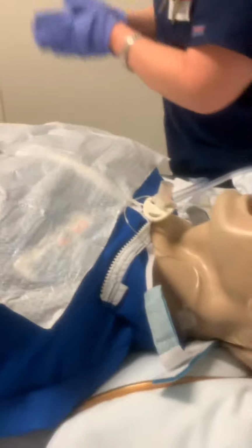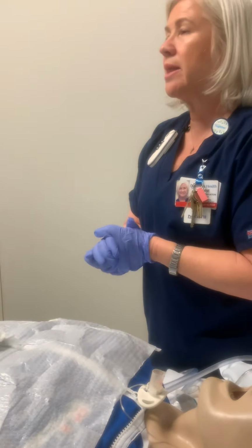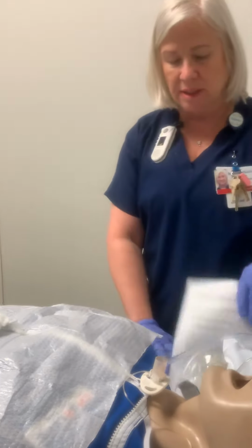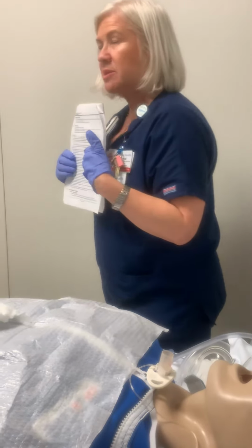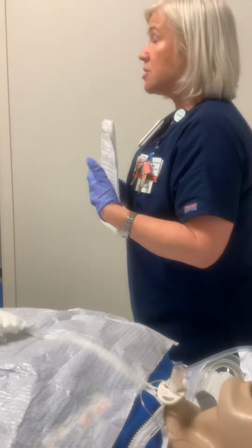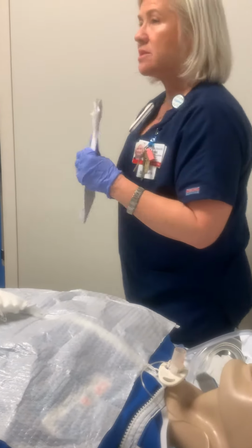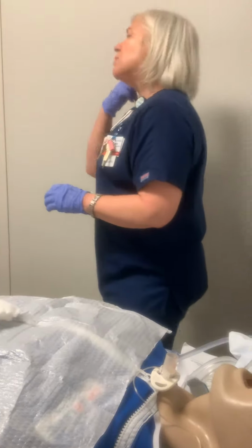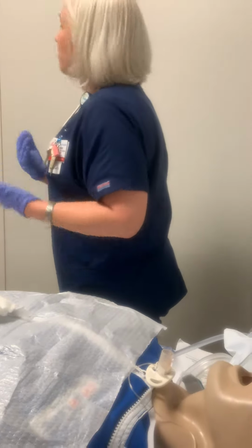So it is a shared responsibility here at Banner Gateway. I want to impress that upon you, because respiratory gets called all the time to do trach care. Well, it spells out real clearly in the Banner policy and procedure that it's a shared responsibility at Gateway. In some facilities you go to in Banner, it's fully respiratory, but it must be done twice a day or more frequently if it's soiled. So always read your policy and be really careful, because sometimes what you've been told may not be accurate.